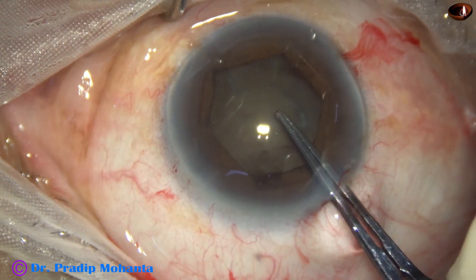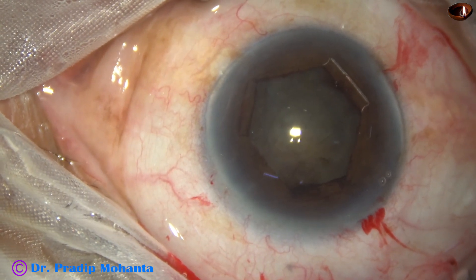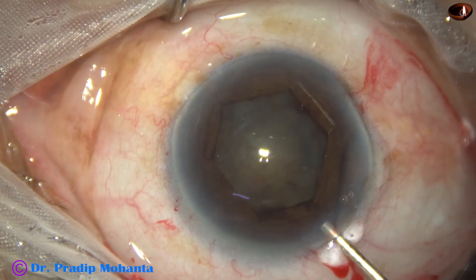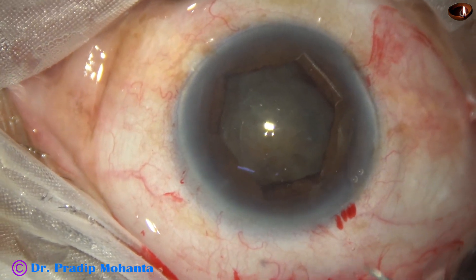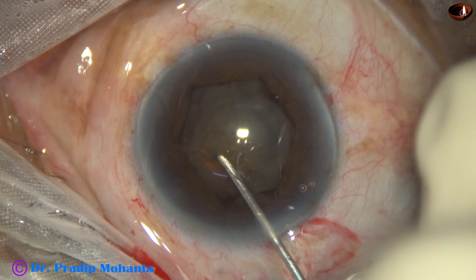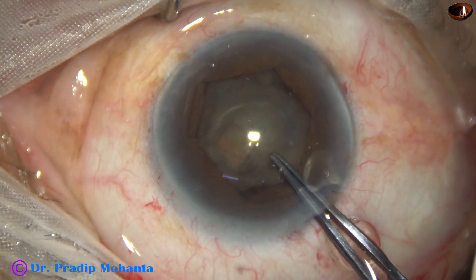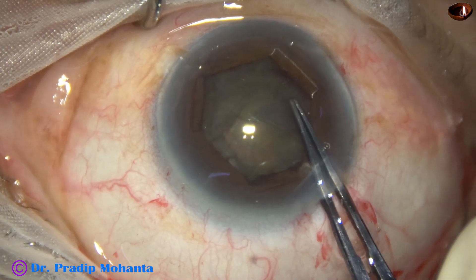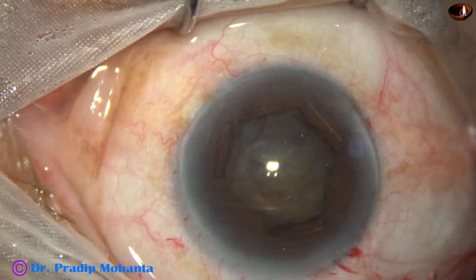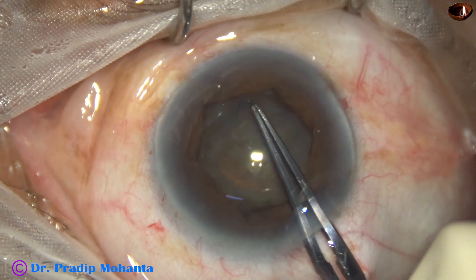Now is the time to do the capsulorhexis. I attempted to pierce the capsule with the utrata forceps but found it difficult because of zonular weakness. So I take a sharp bent 26-gauge needle to cut the anterior capsule. I hold this capsular tag and go anti-clockwise along the border of the hexagonal pupil. I inject viscoelastic again and complete the rhexis.